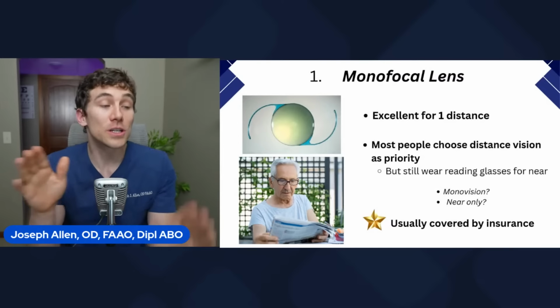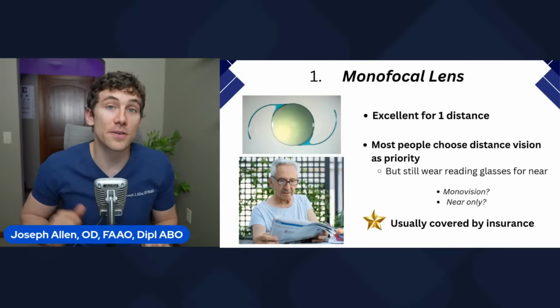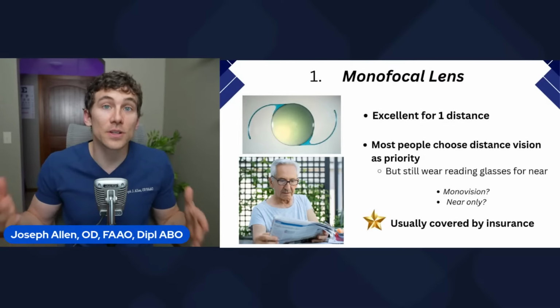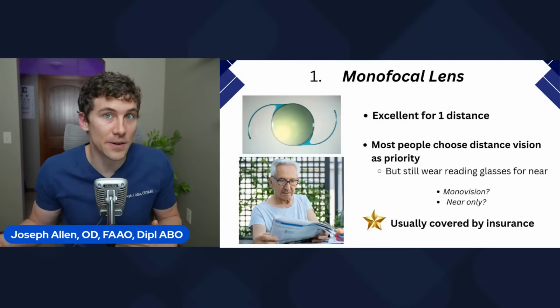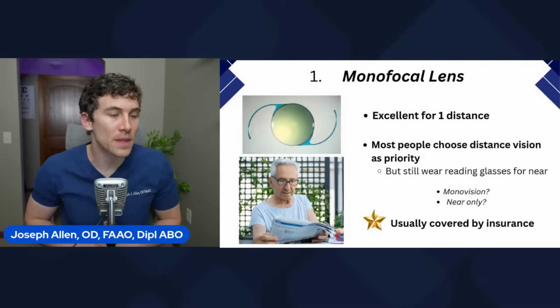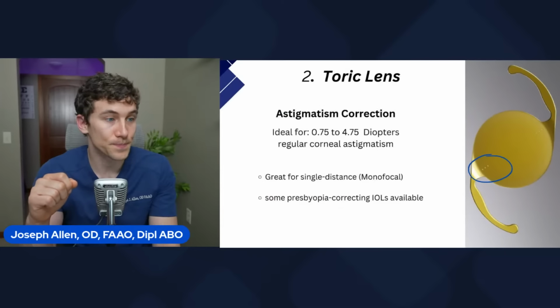The other good component I think people should know about with monofocal lenses is that it's usually covered by insurance. Now, I practice here in the United States, and most of our viewers are from the US. If you have medical insurance, most medical insurances will cover cataract surgery if it is medically necessary. And nobody's going to really refer you for cataract surgery unless it's medically necessary. But we'll talk more about price and insurance coverage and all of that later in our education.